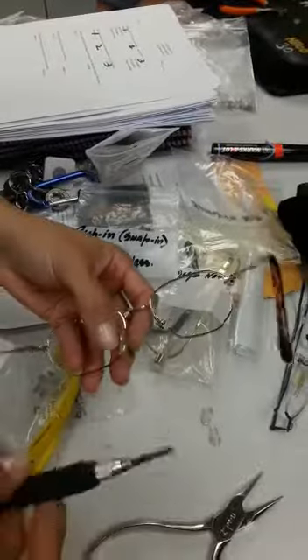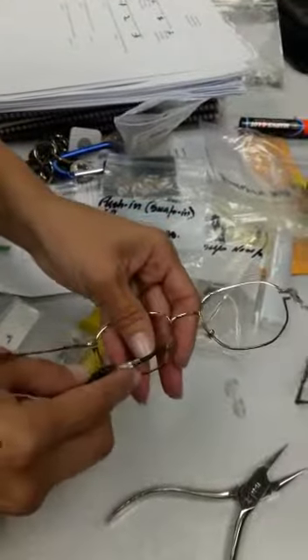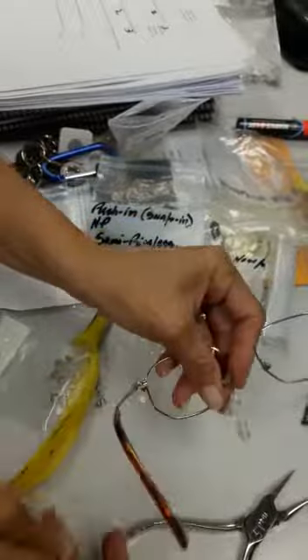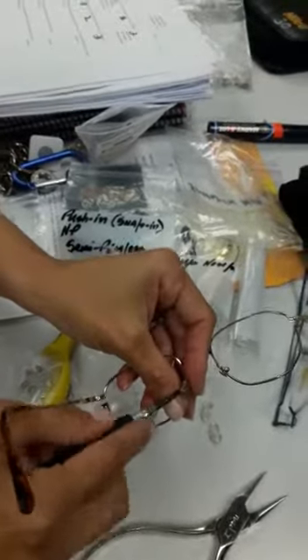Now we are going to replace a screw-in nose pad. So let's pretend this nose pad is broken. So you want to make sure, normally I have a lens on this side to support. You're going to go around, take it out.